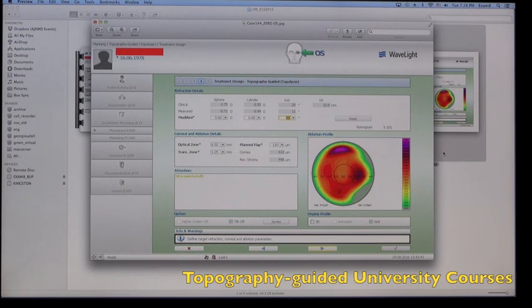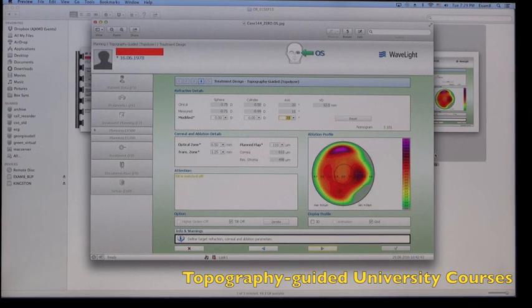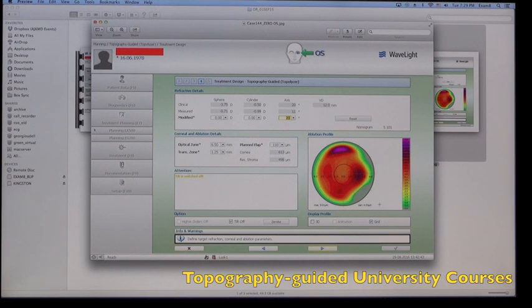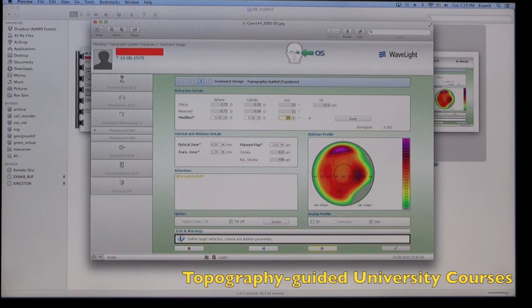That the laser wants to do in relation to the pupillary aperture which is the black round circle on the treatment plan, which is on the bottom right. And then in the modification, we're putting refraction for sphere and cylinder zero just to be able to see that image and see how the topography-guided software will manipulate the result.